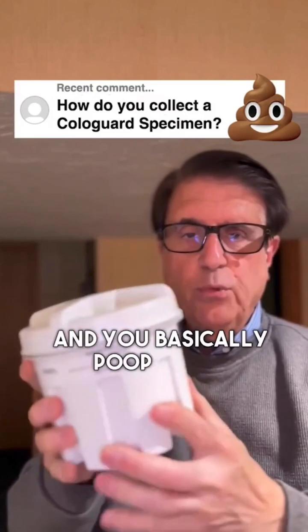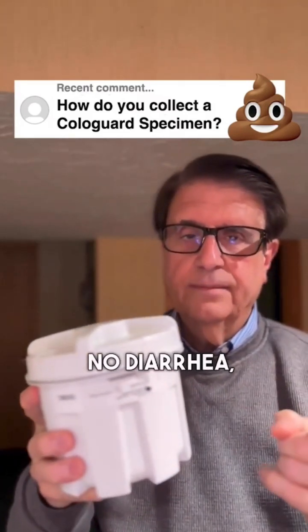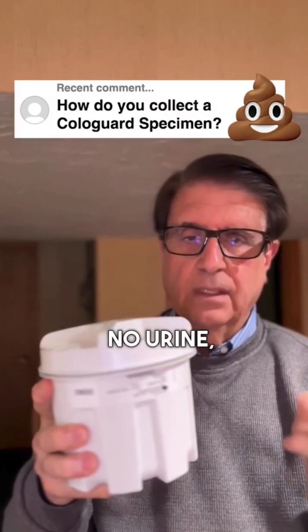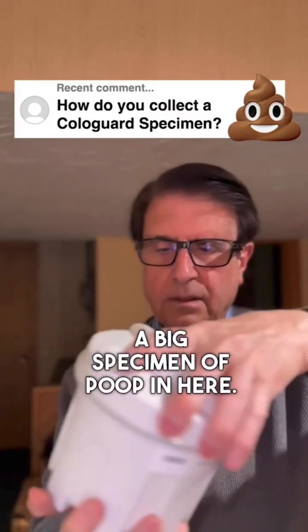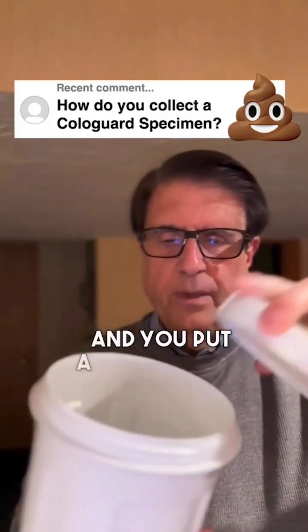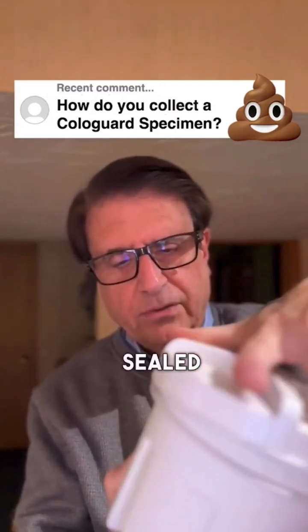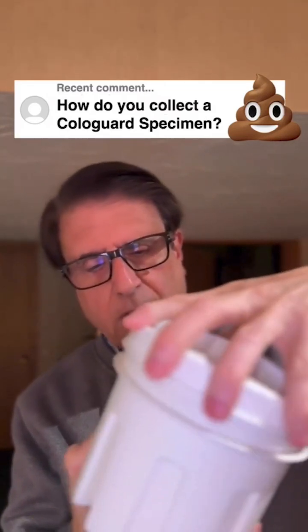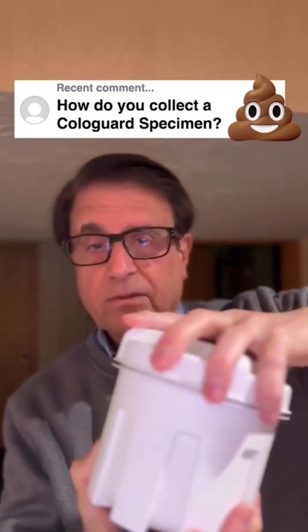You basically poop in this container — no diarrhea, no urine, no blood — you just get a big specimen of poop in here. You can see it opens up like that. Then you put a preservative in there and you seal it very carefully — make sure it's sealed tight, of course.